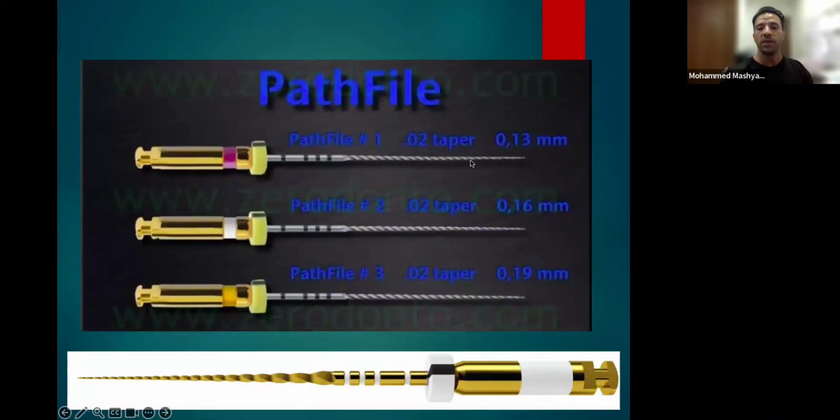So here some files are rotary files to do the glide path. It's very small files. The tip is 13 and taper is 02. It's like the regular hand file, and it's very flexible. And you can always use other companies' files like the one down, which is like progressive taper. Those ones have a fixed taper. They all look the same, right?